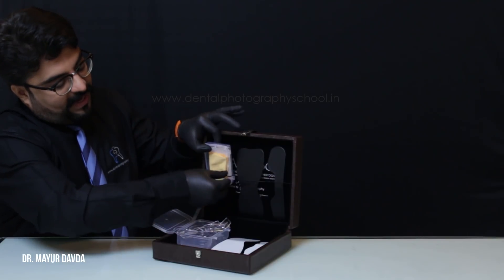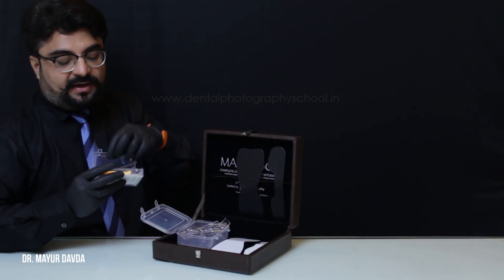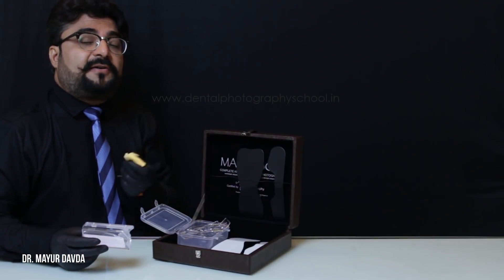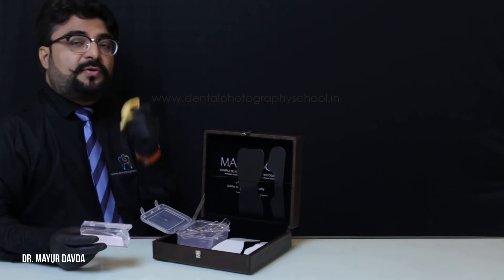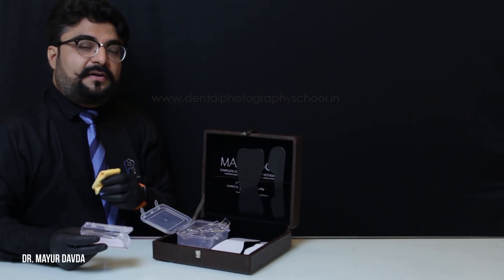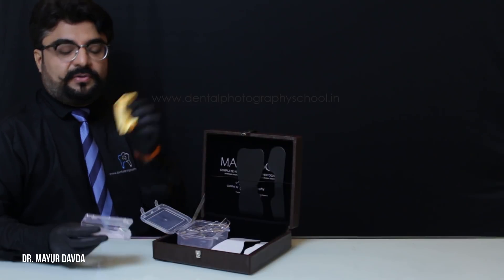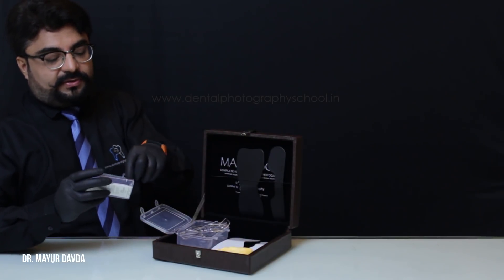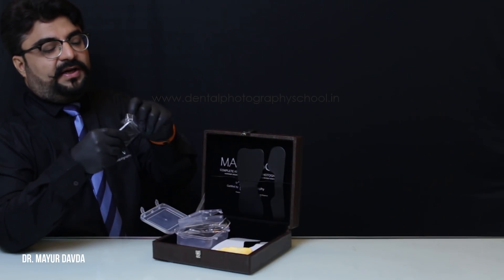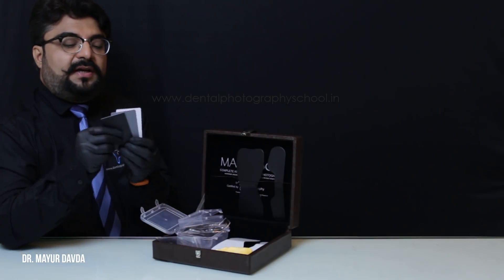An absolute must-have for all the dentists who do a lot of prosthesis in the clinic is the grey card. The microfiber cloth is also included — if there's a splatter of blood, saliva, or if you want to clean your accessories, don't scrub with cotton tissue or gauze; use this microfiber cloth to prevent scratches on your contrastors or mirrors. We have three cards in this box: one white card, one black card, and one grey card.